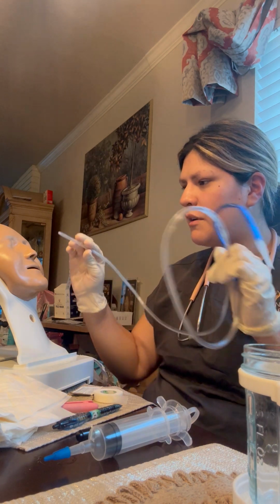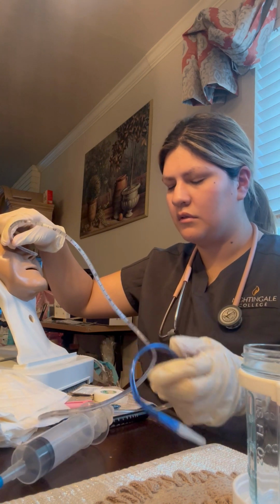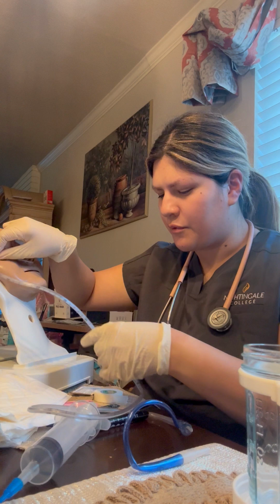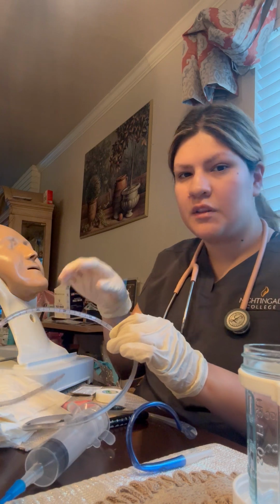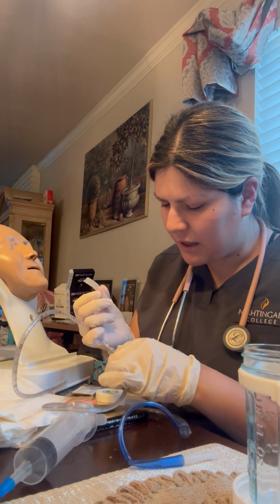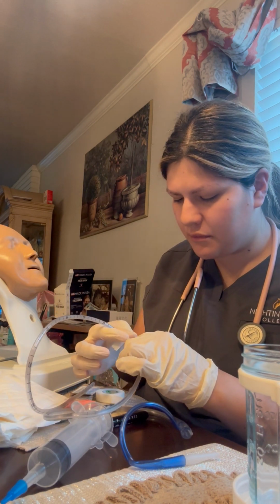I'm going to measure from the nose to the ear and then down to the xiphoid process. And it looks to be about 50. So I'm just going to take my tape and place it at the 50, so it kind of gives me an indication of when to stop.